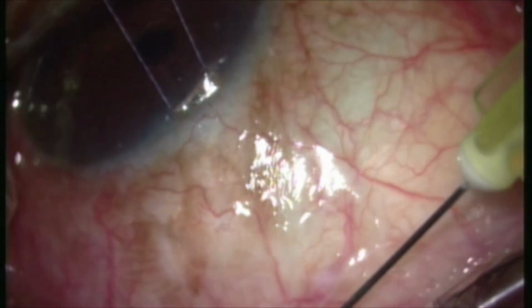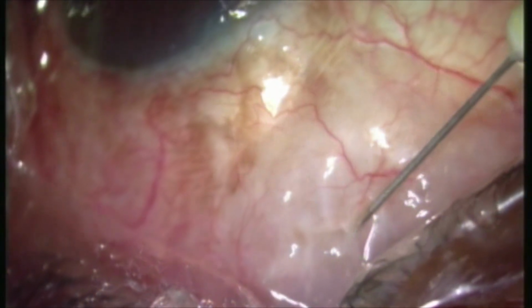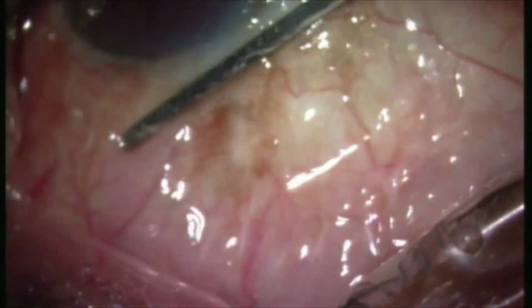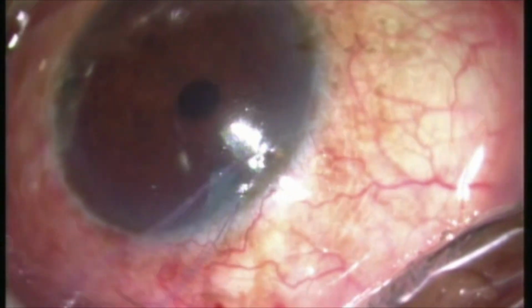MMC is injected 6 to 8 mm behind the limbus. A spatula is used to prevent excessive anterior migration of mitomycin C. Paracentesis is created. The chamber is formed using OVD.